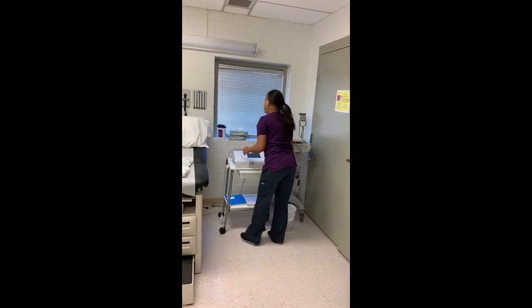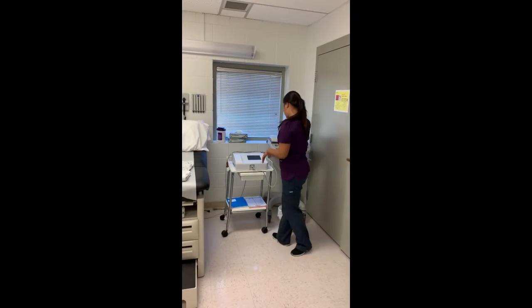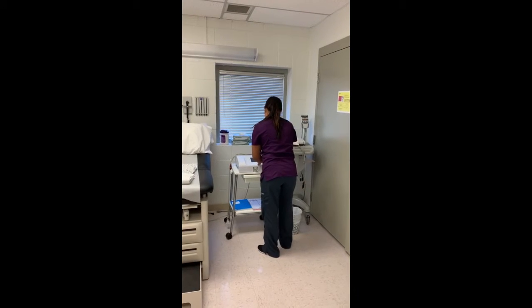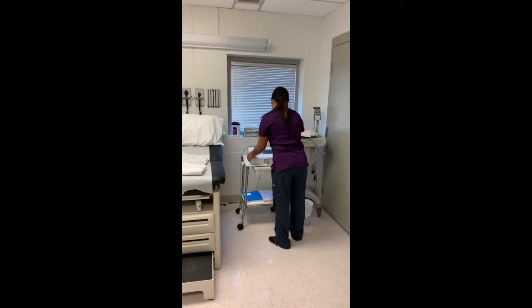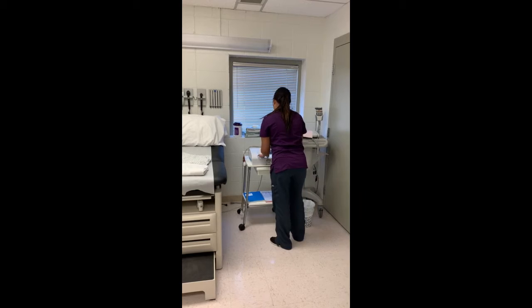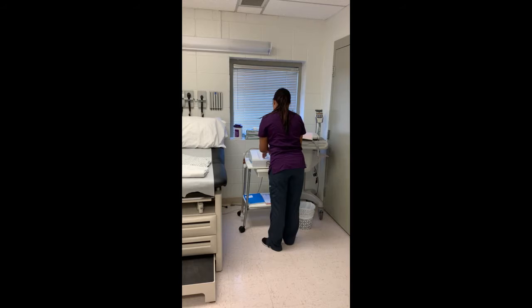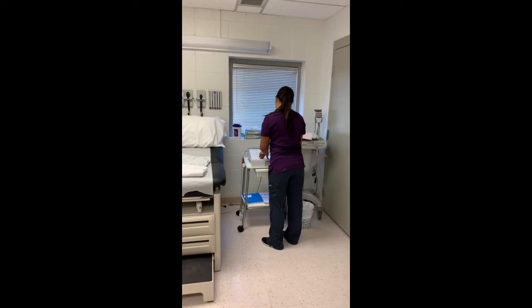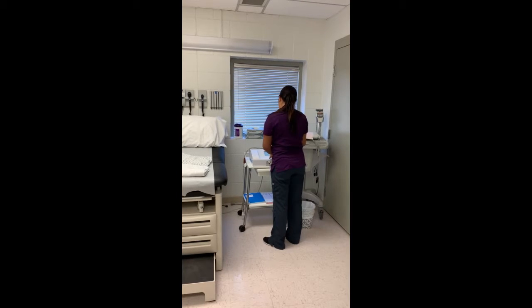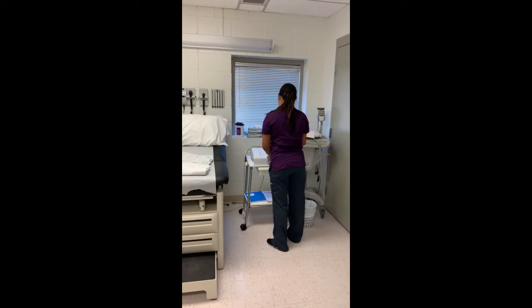Now I'm going to put in the data from the order the patient has, so I'm going to turn it on. I'm going to put in the patient's first and last name, the age, the sex, the height, the weight, the medical history, and also the medications that he's taking for the heart. Okay. All right.